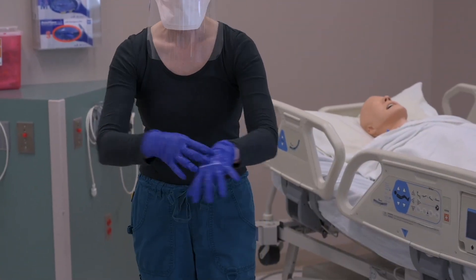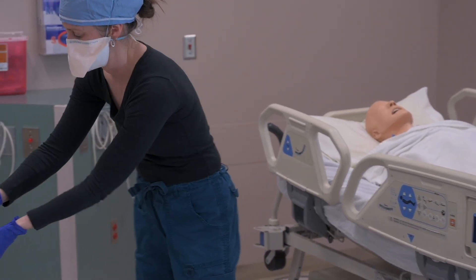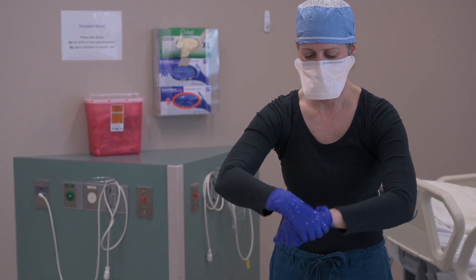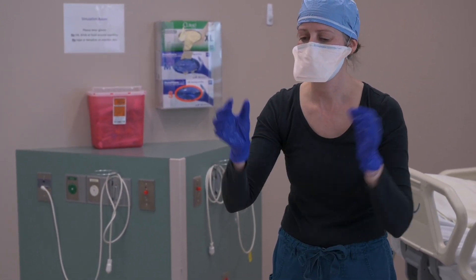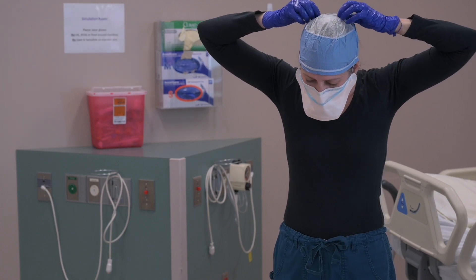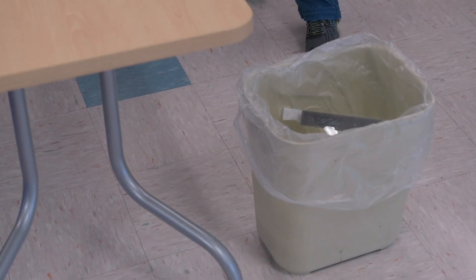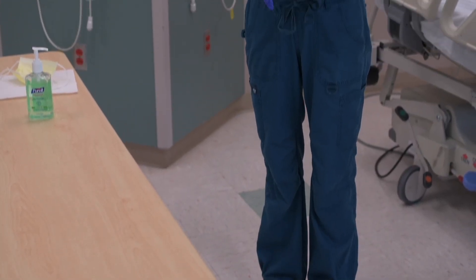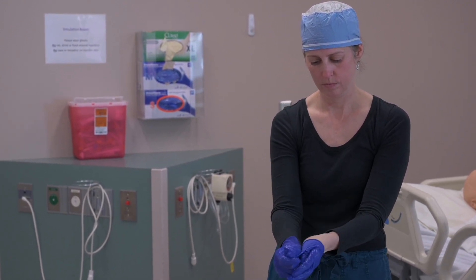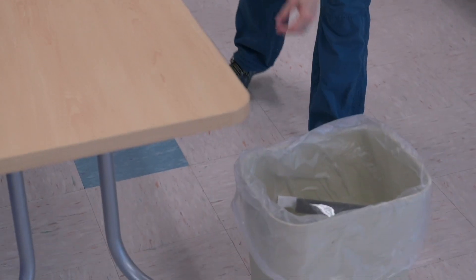Brooke, now you're going to doff that face shield — just reach back and grab that strap, gently lift it off forward, and place it in the garbage can, then perform hand hygiene. Now you're going to doff that mask — same forward motion, starting with the lower straps, gently lifting that off, then grab the upper strap and gently lift that off, being very careful not to touch the outside of that mask. Perform hand hygiene. Then you're going to finish by doffing those gloves using that same glove-in-glove technique, and perform hand hygiene.